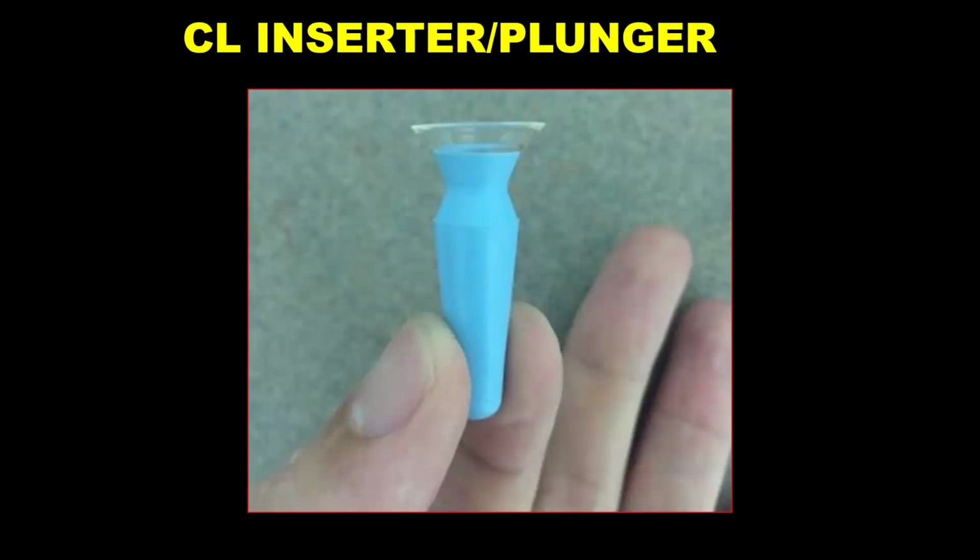It requires a lot of technique, a lot of skill, and a lot of practice to learn. Because it's bigger and has to be inserted on the sclera, care is taken so you can insert it properly.